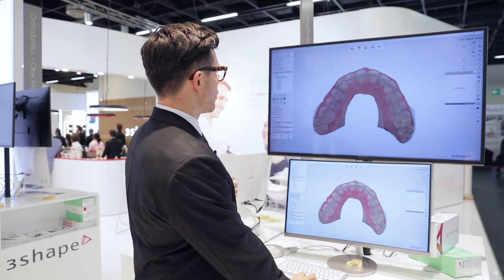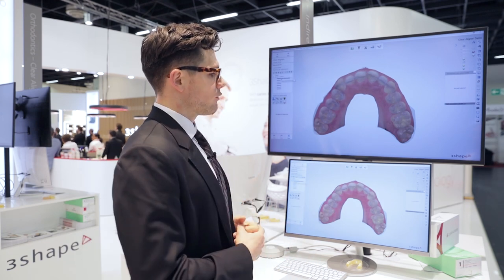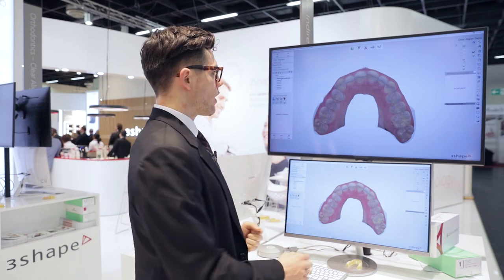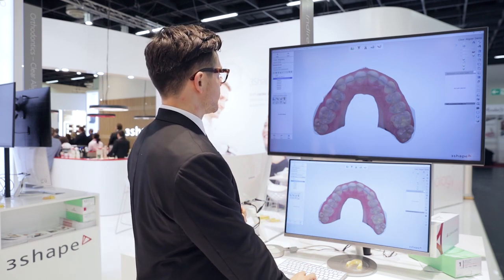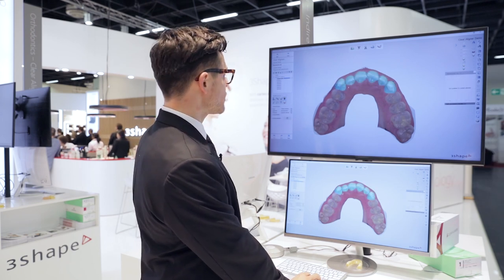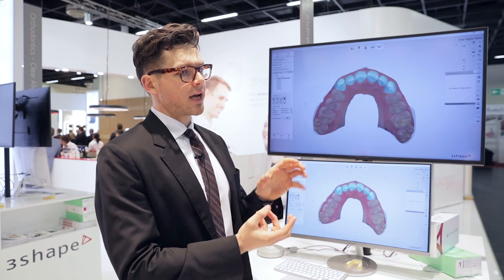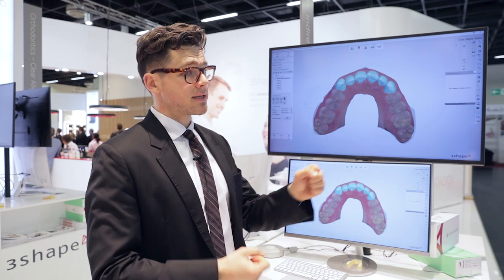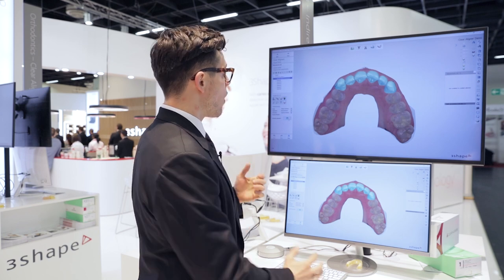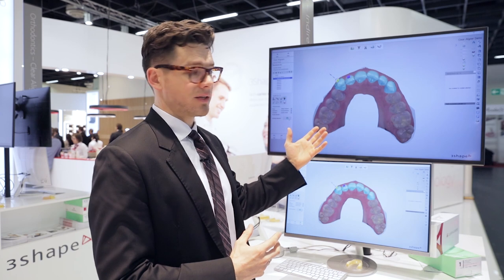The next thing I'd like to show you is putting on attachments. Attachments for certain types of treatments are more or less a requirement, or at least will speed up the treatment a lot. I'm just going to select a few teeth here. It used to be that you had to manually put on the attachments, resize them, and figure out where they went. But now with our new automatic placement feature, it actually goes on automatically — that's how fast it took.